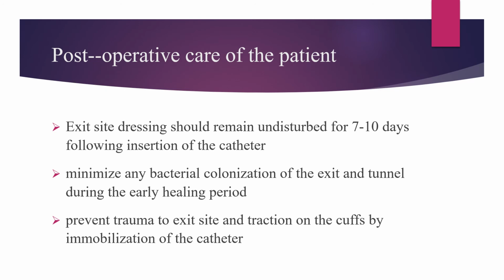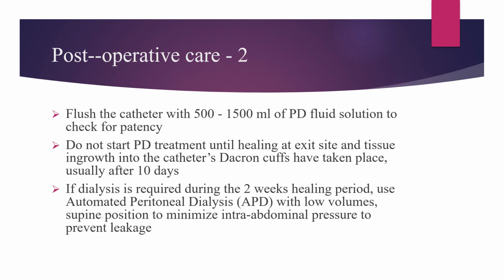Prevent any trauma to the exit site and traction on the cuffs by immobilization of the catheter. Flush the catheter with 1 liter of PD fluid solution to check for patency.